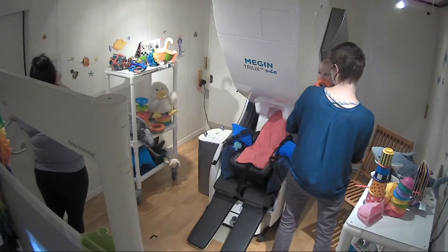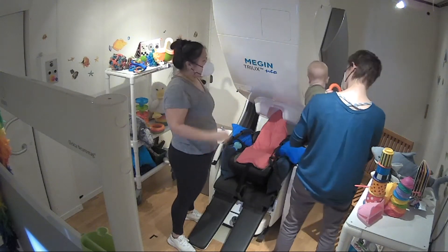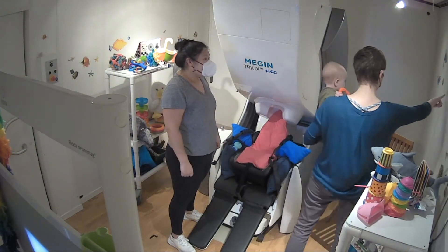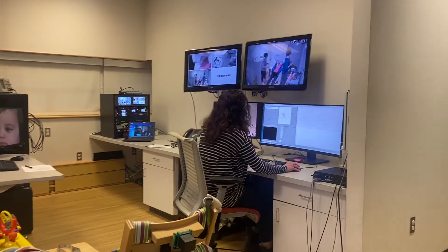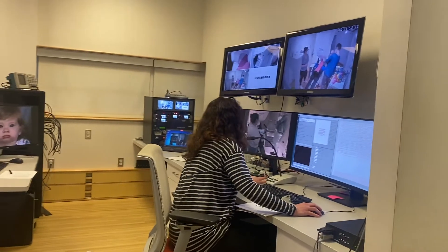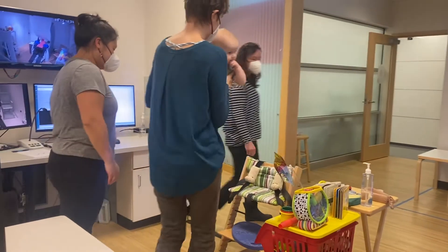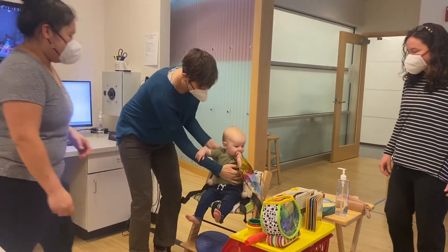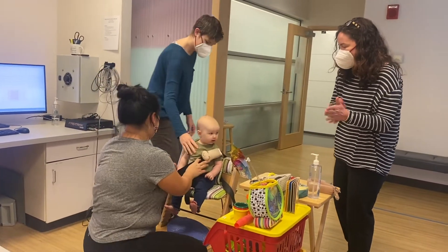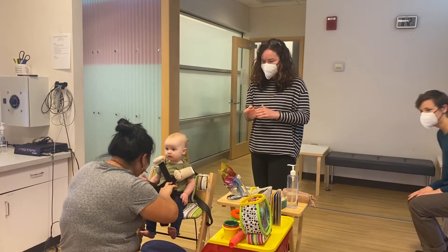After the family's arrival, we check those who will be entering the MSR for ferrous material. We have the parent, infant, and staff member move close to the sensors while the technician checks for any interference. If there is interference, we have parent and infant change into metal-free clothing. Once the family is ready, the parent places the infant into the high chair for digitization. A trained assistant acts as a toy waiver to engage the infant throughout the rest of the appointment.